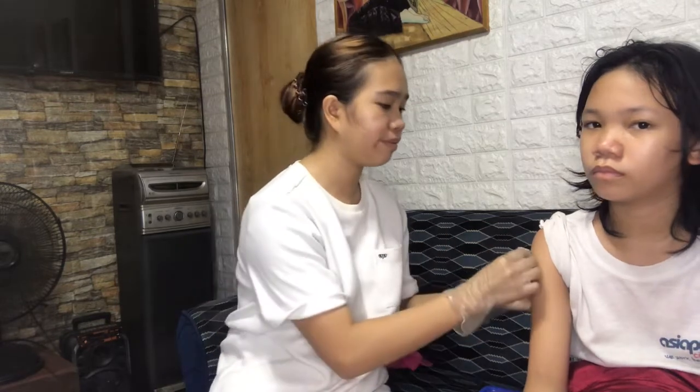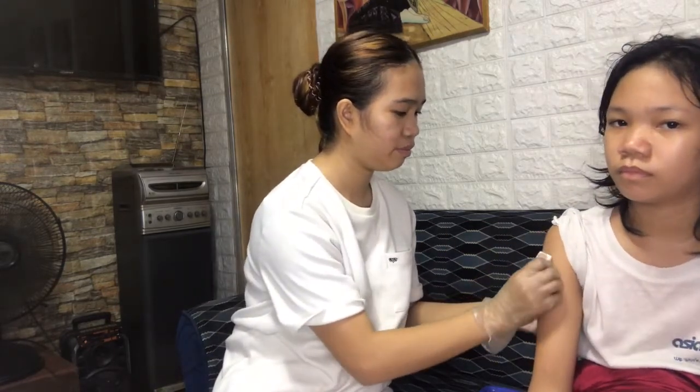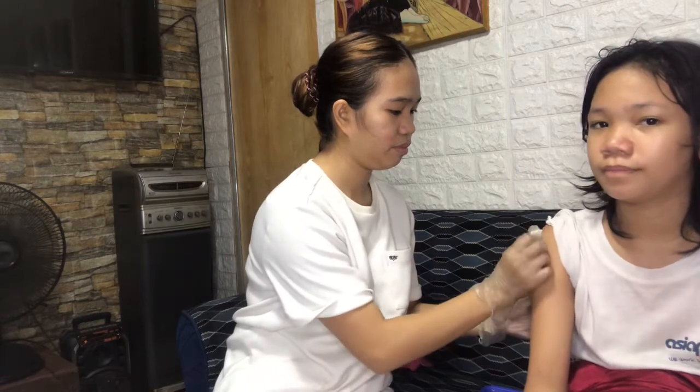I already applied the clean gloves, and now let's clean the selected site with the alcohol swab or alcohol wipes in a circular motion. Next, transfer and hold the swab between the third and fourth fingers of your non-dominant hand in readiness for withdrawal, or position the swab on the client's skin above the intended site. Then prepare the syringe for injection.